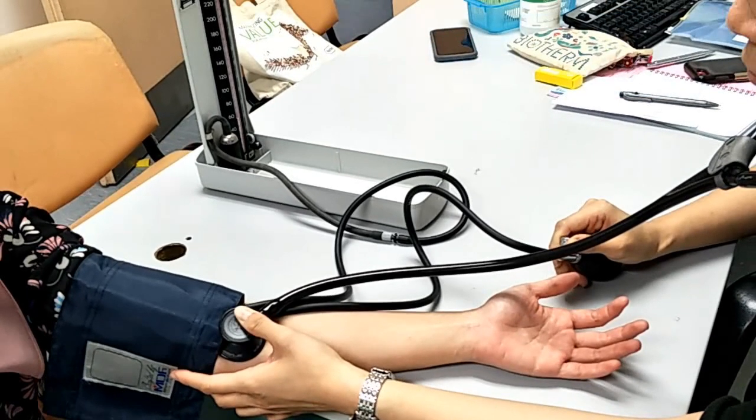Continue to deflate the cuff until the Korotkoff sound disappears. The reading you see when the sound diminishes or disappears marks the diastolic blood pressure.